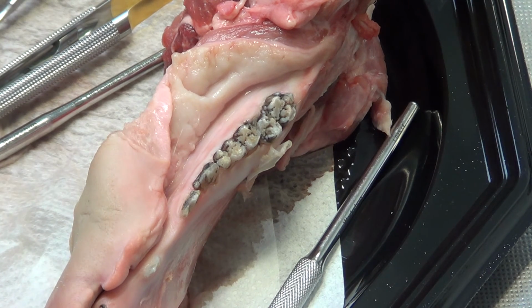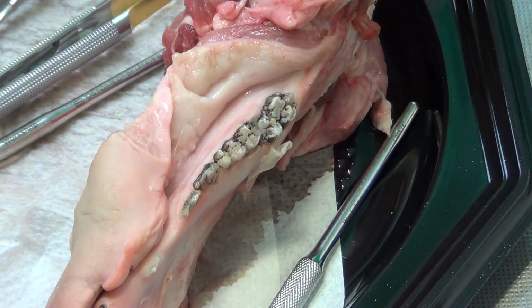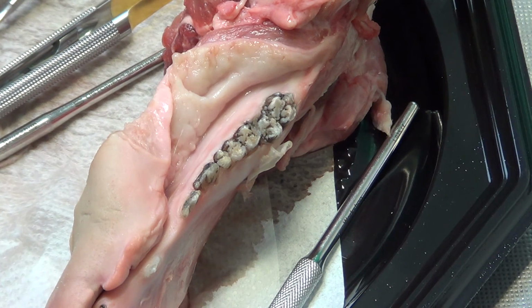I do a little bit more, yeah, because the mesial incision is not like this, but yeah, you have to go a little bit deeper with this incision. Okay, okay. So now you are able to fix it to the periosteum. Perfect. Yeah, but you haven't done the 2 vertical incisions. Do you remember? There is one vertical incision in the mesial part and one in the distal part. Yeah, and you have to do it at the beginning to obtain the correct height of the tissue.